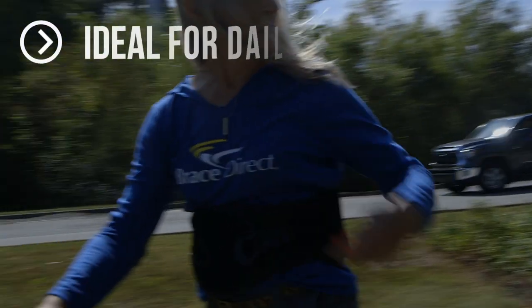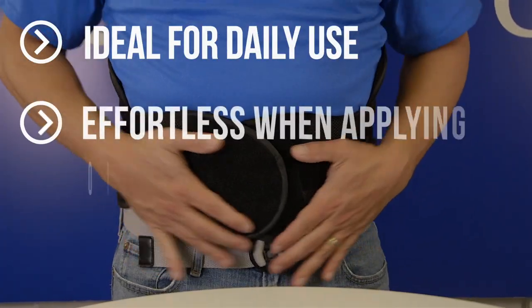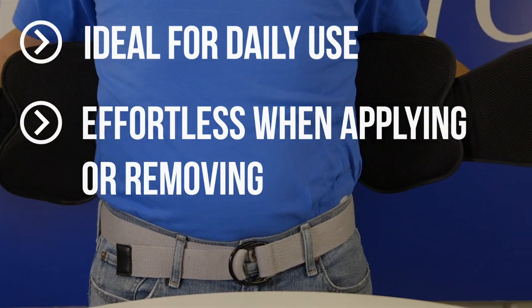BraceDirect's lumbar support is compact and made of breathable, lightweight material making it ideal for daily use. The finger loops make the brace effortless while applying or removing, regardless of your upper body strength.